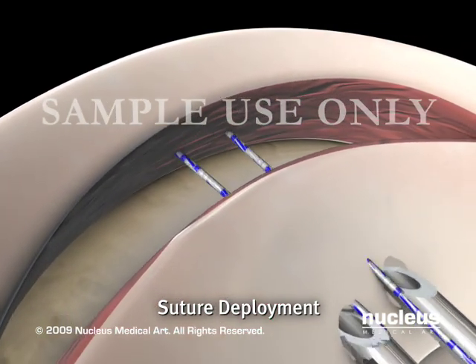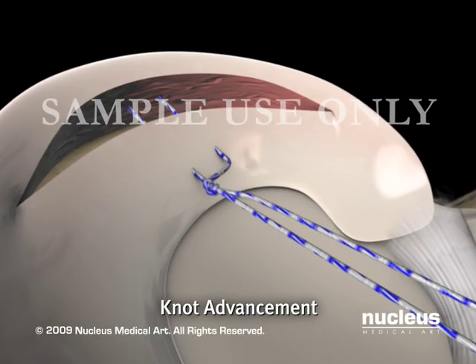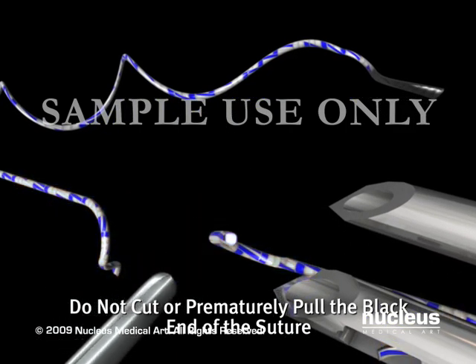The delivery needles are removed from the knee, and a sliding knot advances into position. The post end of the suture is cut off of the device. The cut white end is the post end, and the curly black end is the locking end.